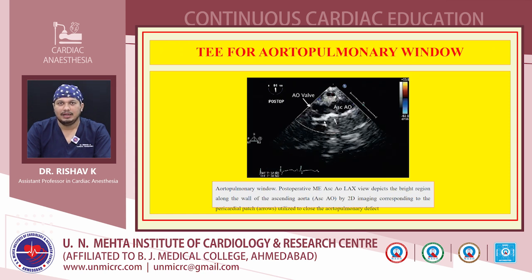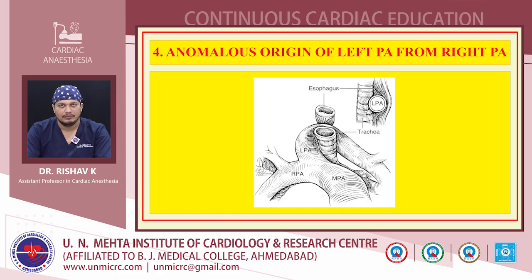Also, coming to the mid-esophageal ascending aortic long axis view, which is a post-operative image, it shows the patch repair that has been done, shown by the bright region along the wall of the ascending aorta, and this has been utilized to close the aortopulmonary defect. We have used color flow Doppler here to rule out any residual flows.